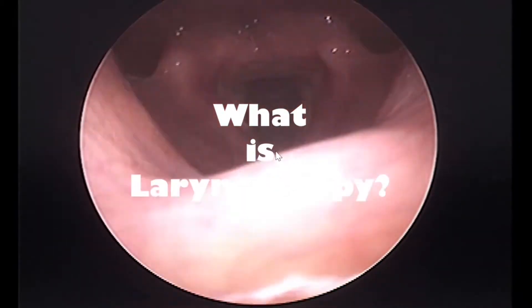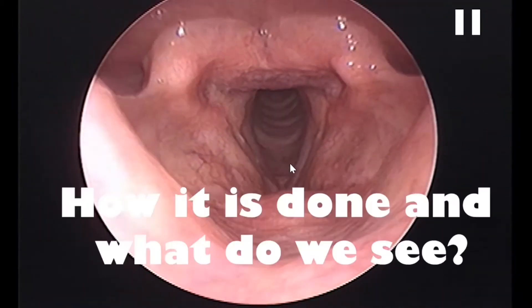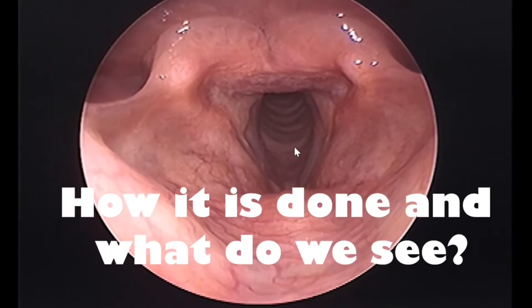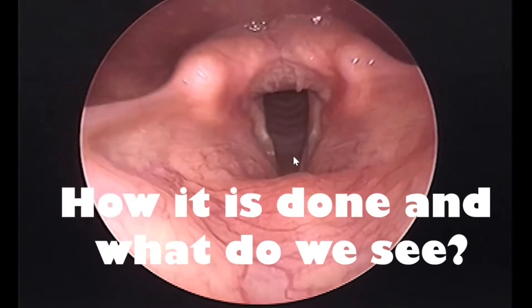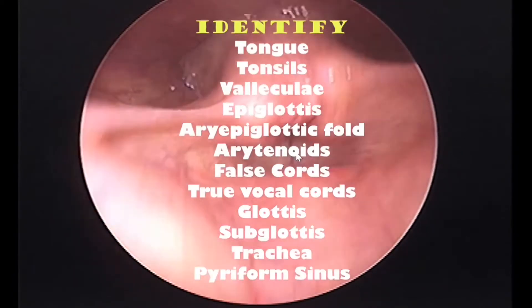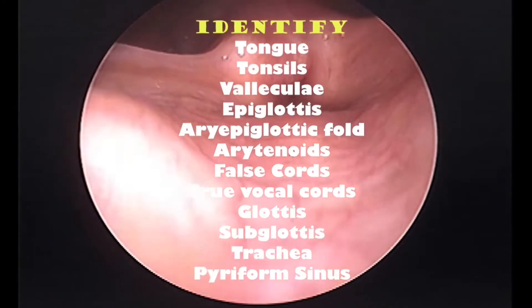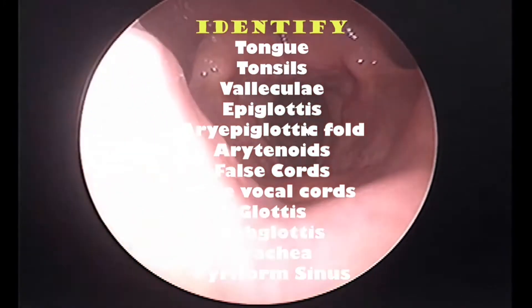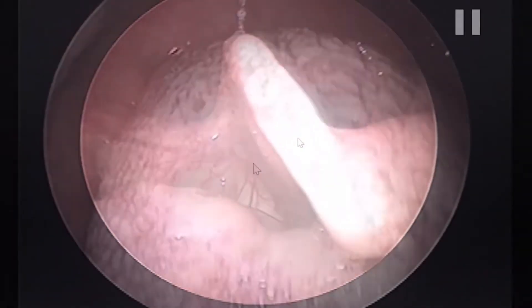Laryngoscopy is a procedure in which the doctor uses instruments to see the vocal cord and nearby structures. This is usually done under topical anesthesia, and these are the structures which may be identified during laryngoscopy.